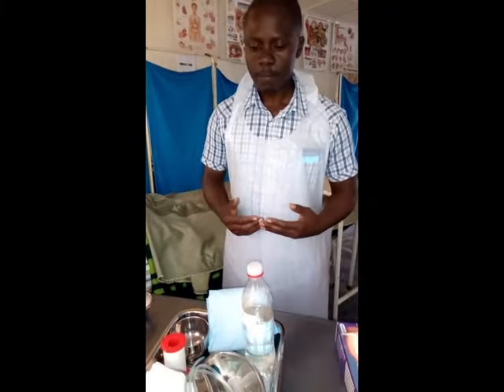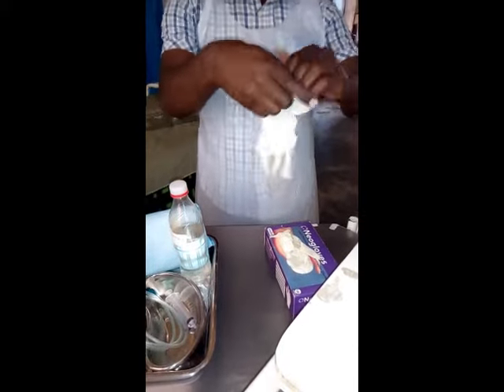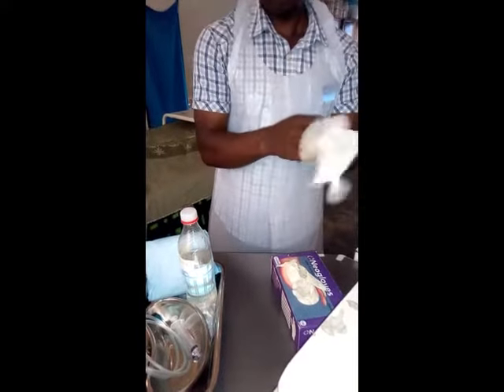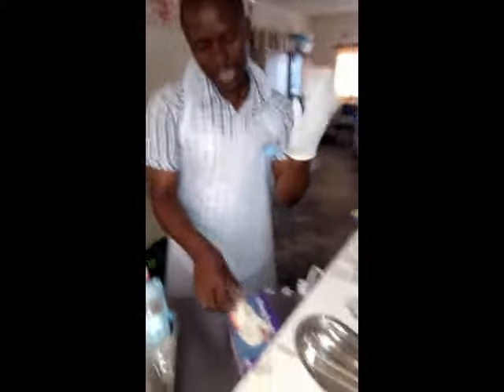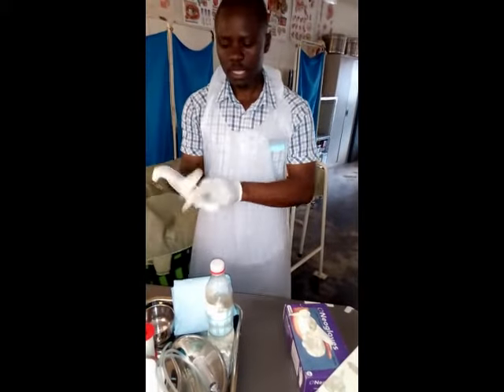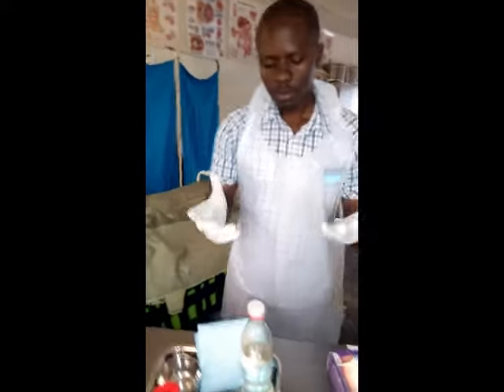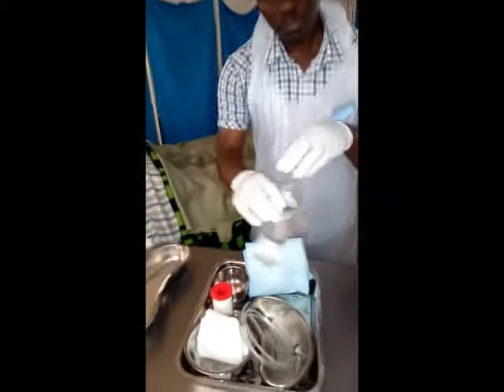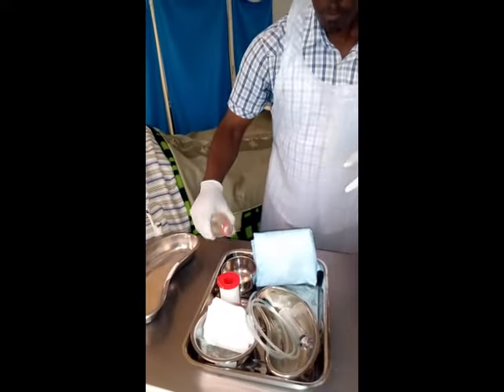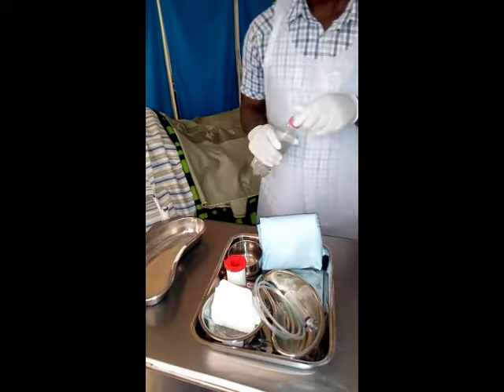So for us to know that this nostril is patent or the other one is more patent, we need to do the following. Okay, so we need to glove up. So this is a clean procedure. No need of getting worried to say it's a sterile one or something. Then need to pour solution before you touch anything else. So label in your palm. Okay, so this is for lubricating the tube.